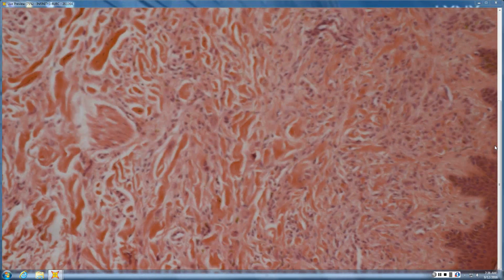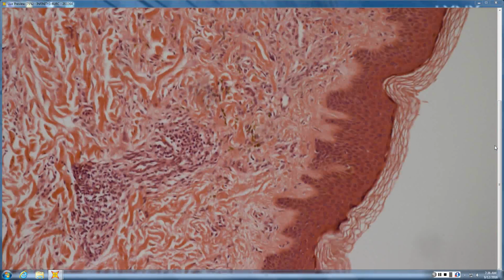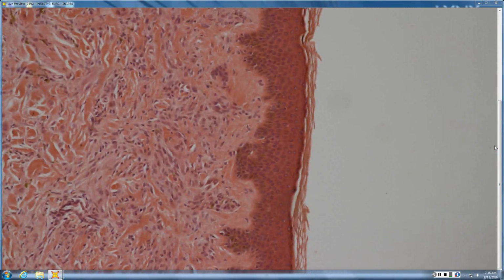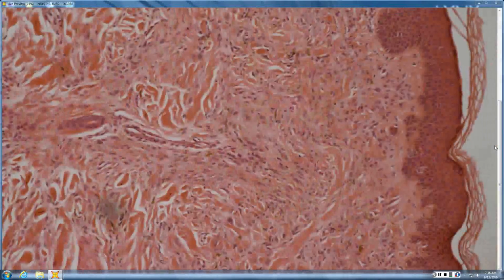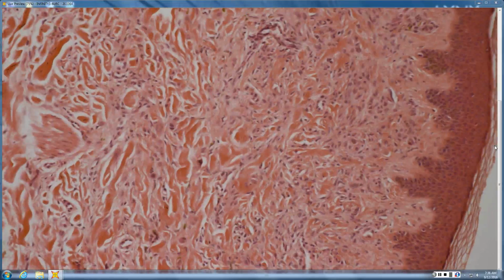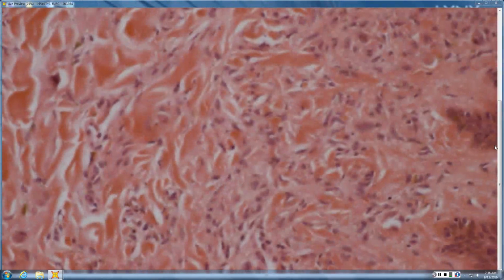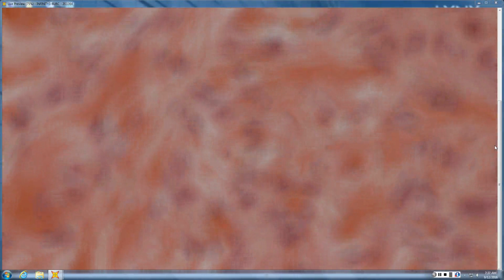So it looks like there is some melanocytic proliferation along the epidermal junction, but I also see some... Yeah, a little bit at the deep junction. Kind of scattered down below in the dermis. Yeah, it's kind of a busy dermis, right? Yeah. I don't really feel like I'm getting the dendritic appearance. Yeah, definitely not dendritic. So then when you look at them, are they all the same? We got a smudge on that one. So here we go. A little higher where we can focus here.